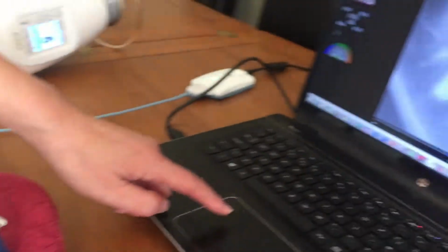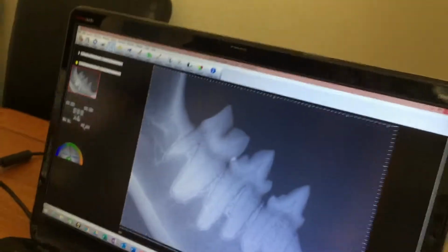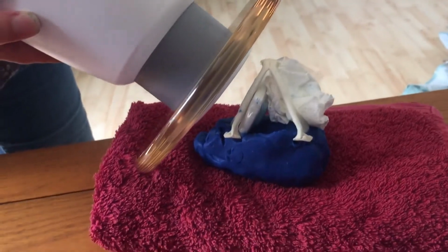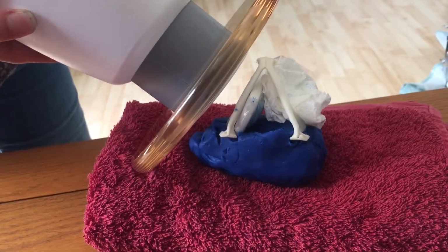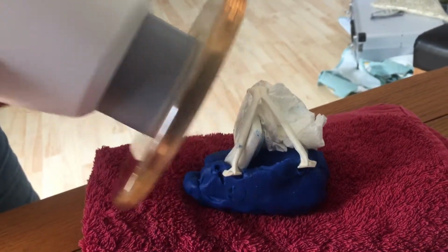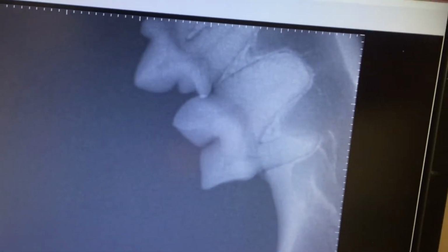So if I get the right box up. So I'm not in any kind of angle, I'm just firing straight on at this sensor, nice and close. And if you look at the screen now, there's our last molar. So you see by pushing this right back and firing against it, we did get the last molar. I'll just rotate that on the screen for you. There you go. So there's the last molar.